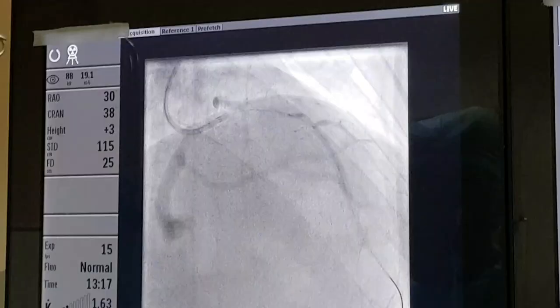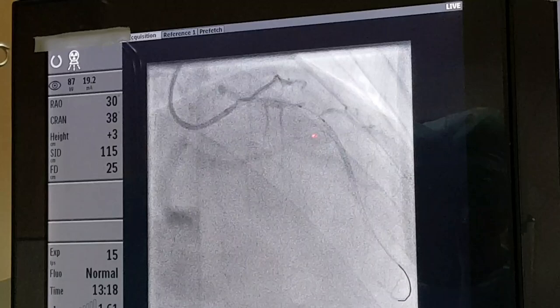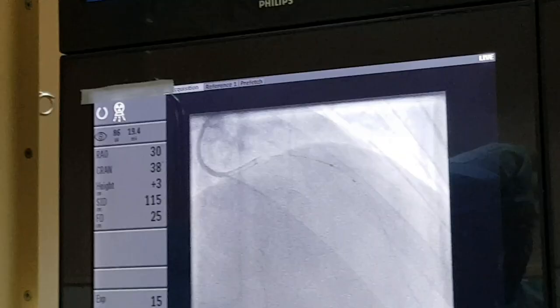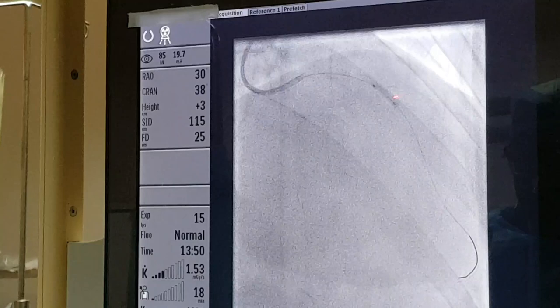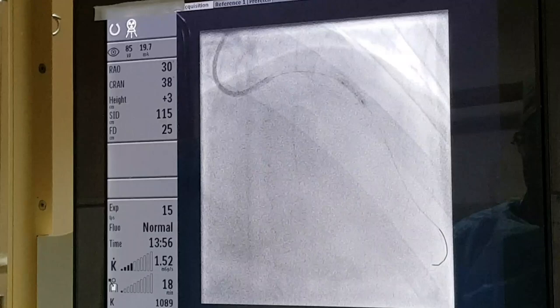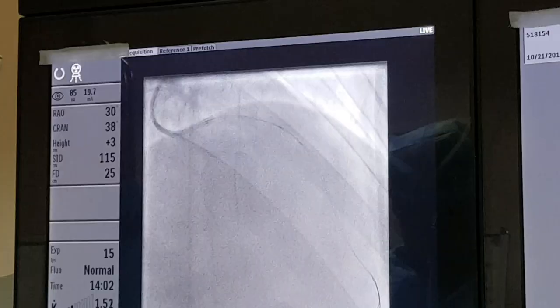Now the balloon is positioned across the block and we will inflate it to open it. Now I am inflating the balloon — you can see the pressure on the dial. You can watch that the block is being opened; it is a tight block but it has opened nicely. The balloon is inflated and the block is open. I check the contrast and yes, it has opened nicely.